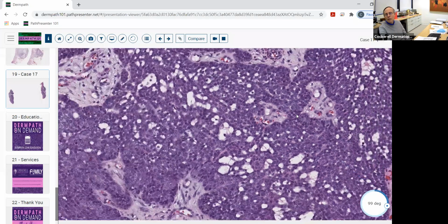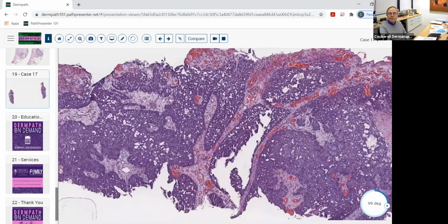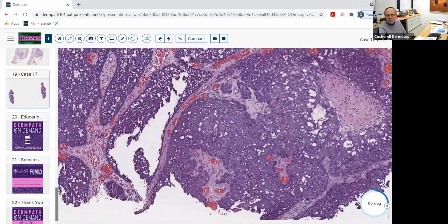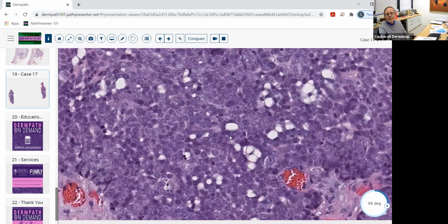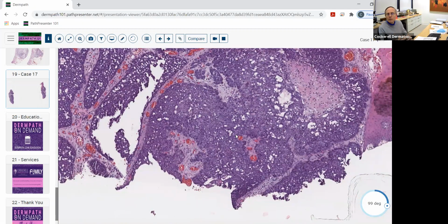So once again, you see something like this, you know you're dealing with a cancer. And if you want to call it a malignant hidradenoma, that's okay. If you want to call it a porocarcinoma, that's okay too. And just recognize that it's got an adenocarcinoma. I mean, that might even be a sebaceous cell. So I don't know for sure that this lesion isn't some variant of a carcinoma that's demonstrating multiple lines of differentiation here.